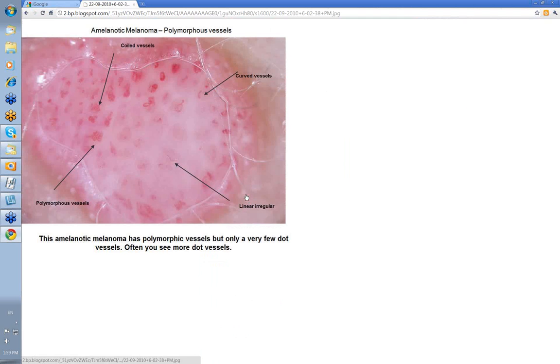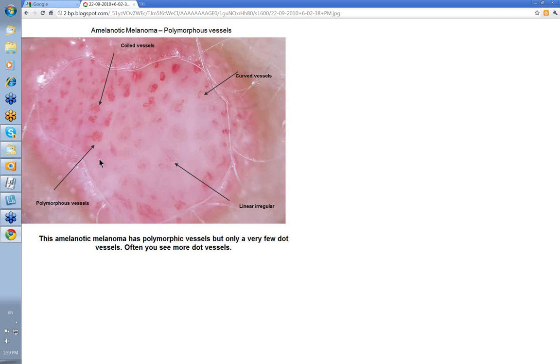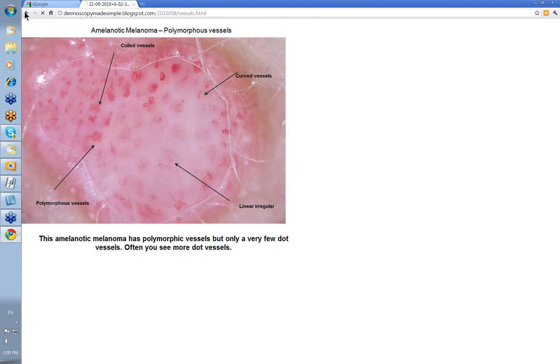We've talked about polymorphous vessels. Polymorphous and dots are very useful for amelanotic melanoma. There weren't many dots in this particular case, but you've certainly got polymorphous vessels here — some curved ones, some linear irregular, some coils. So we call this polymorphous and with dot vessels, it's a hypomelanotic melanoma.